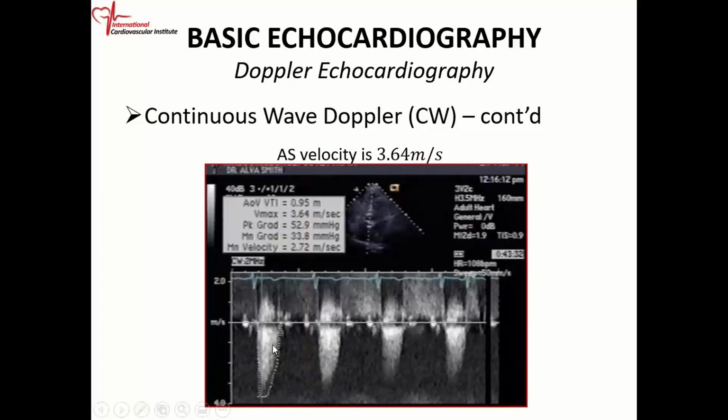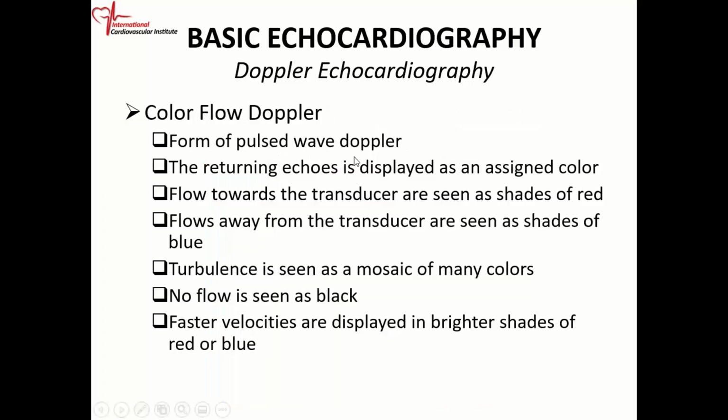Okay? And you can measure the velocity. It's about 3.64 meters per second. Again, the velocity is greater than your 1.5 to 2 meters per second, so you can't use pulse wave Doppler for that.